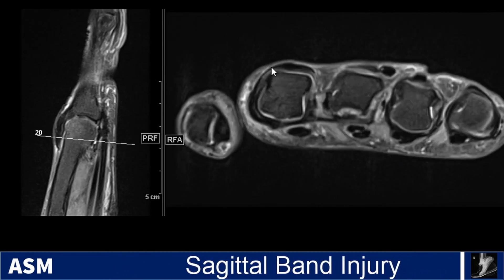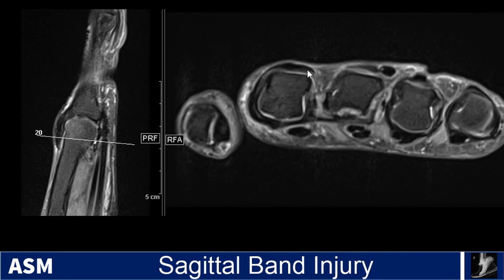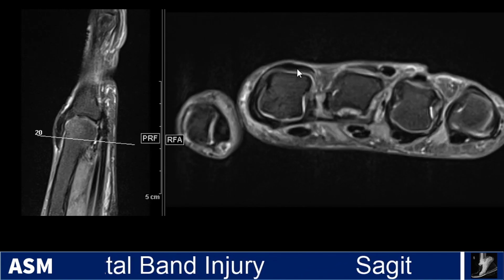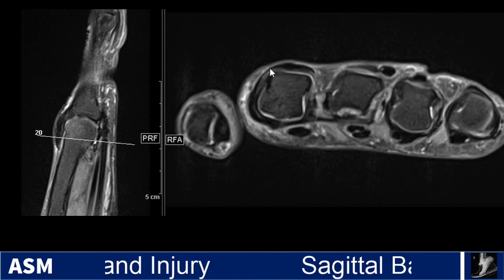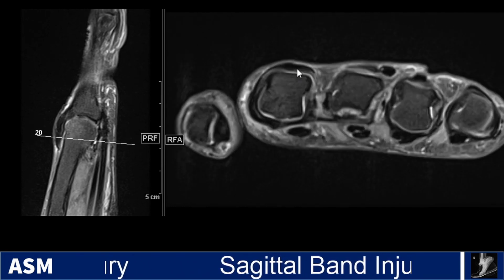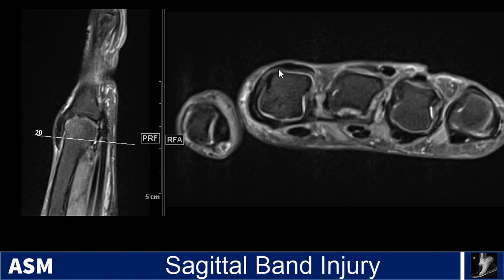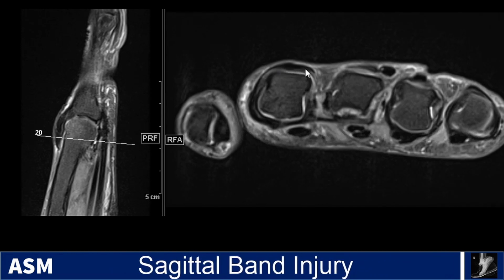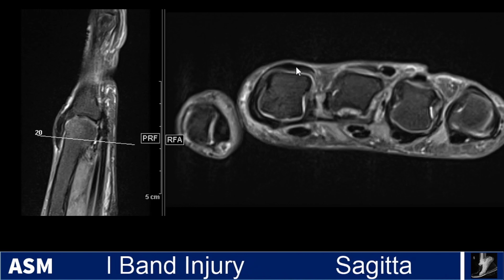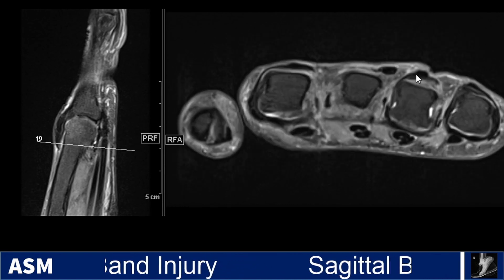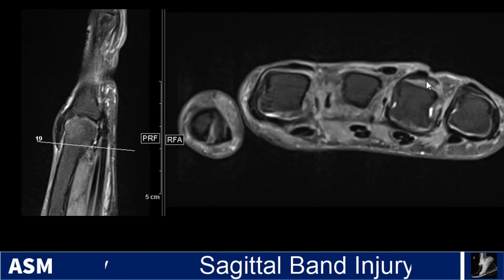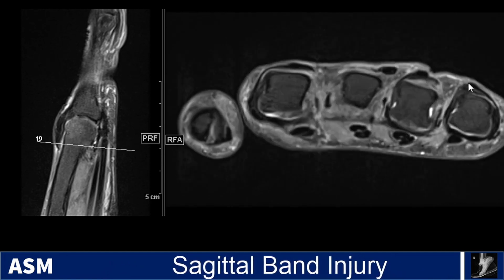The extensor tendons are usually held in place by the sagittal bands at this level — there's a radial sagittal band and an ulnar sagittal band — and this is just part of the extensor apparatus stabilization. They should be thin and hypointense. You can see the second digit, the unaffected one, looking pretty normal. The fourth digit as well, sitting central and dorsal with intact sagittal bands. The same for the fifth.